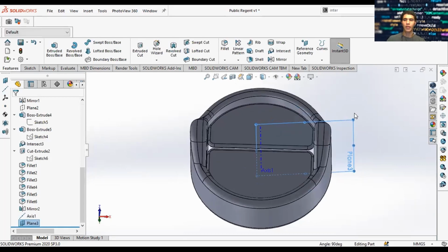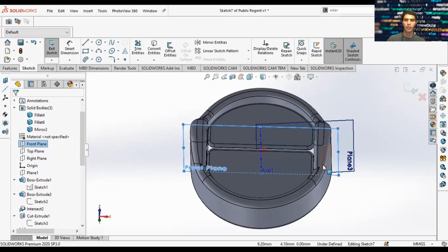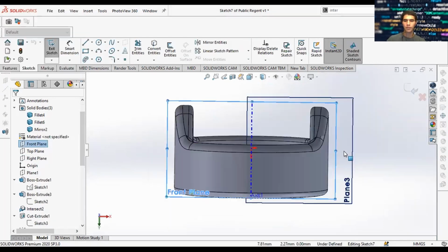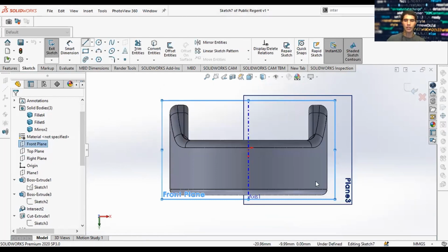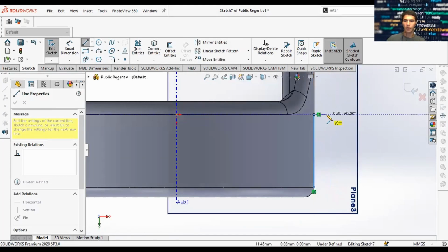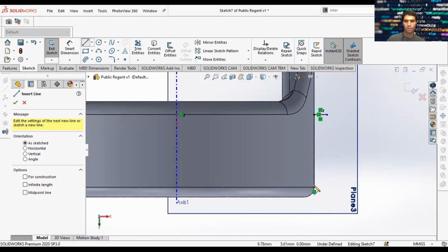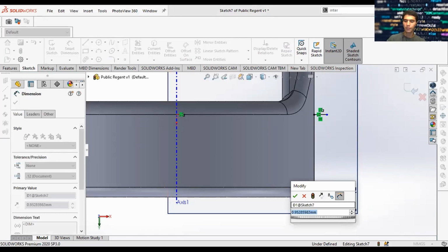And so now we have a plane at 5 degrees offset from our front plane. And so the front plane, let's draw on it. Let's sketch on this front plane now. So let's do a quick save. Or just finish the sketch and then save. So we'll do a sketch from here to here, and then find a way to do the shape of the cuff. And now we'll add some dimensions.